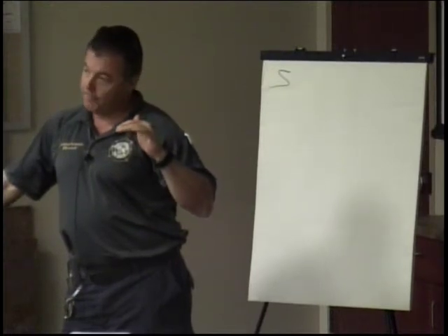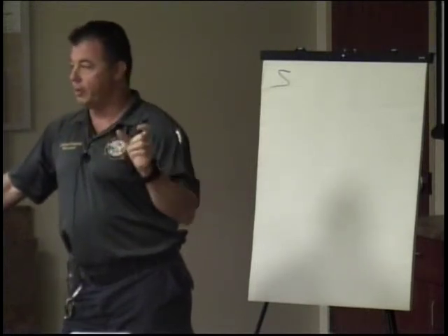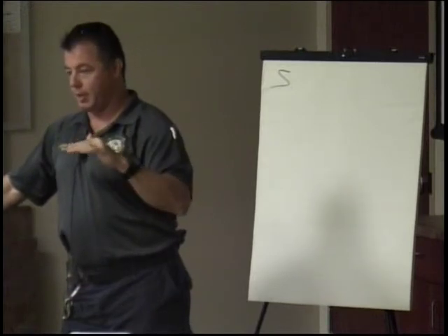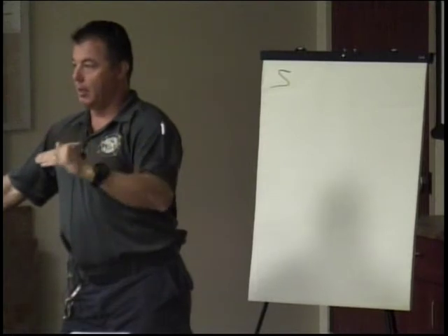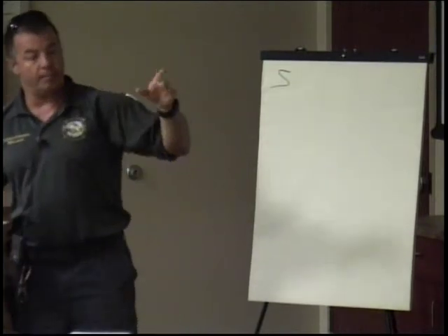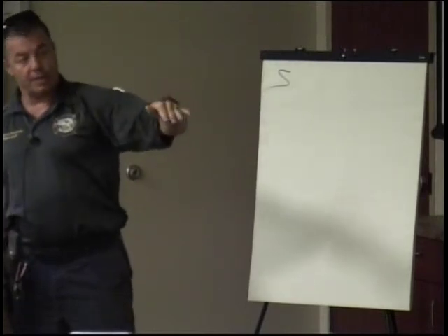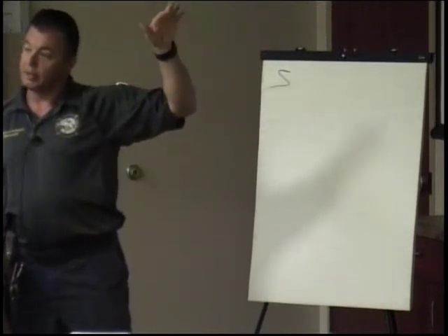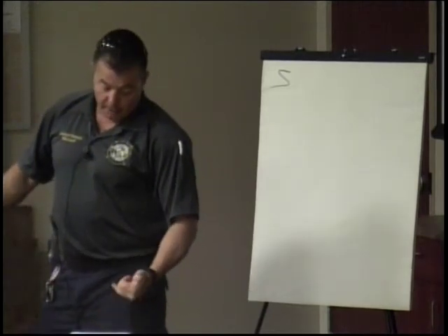Jason, when you say trends, do you mean the way the waveform is taking form? Not the waveform itself, but the trends. It's hard to set up on the monitor, but it gives you a bar every 30 seconds. I tried to pull up a sample of trends because one of my examples needed them, but I couldn't get it off the monitor. But it can help you with your interventions.